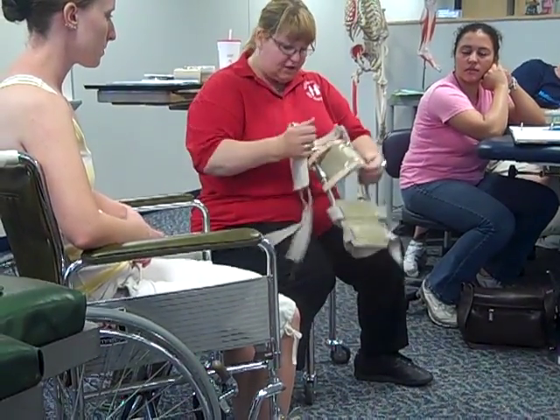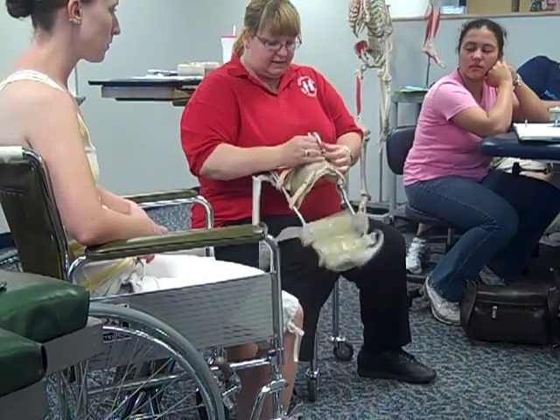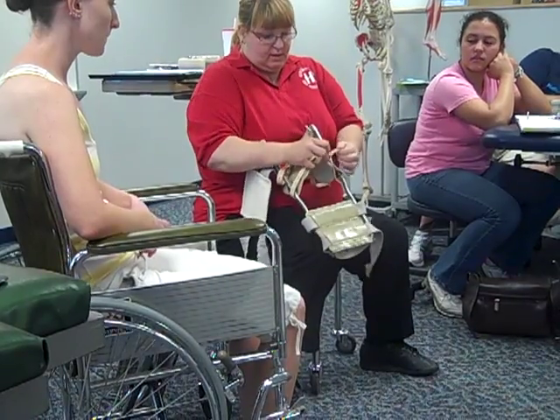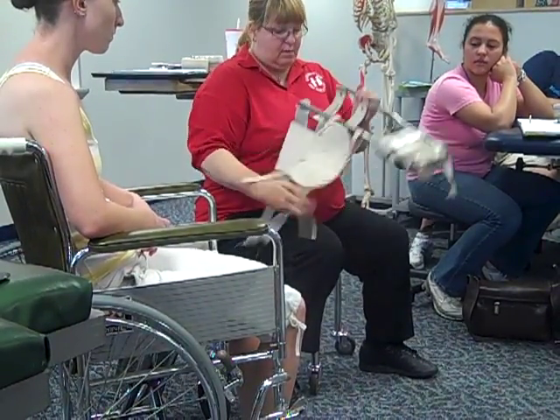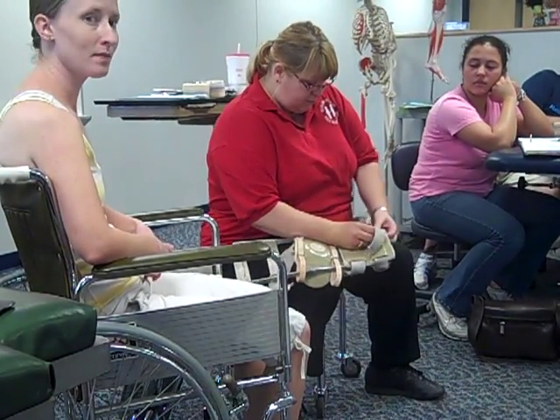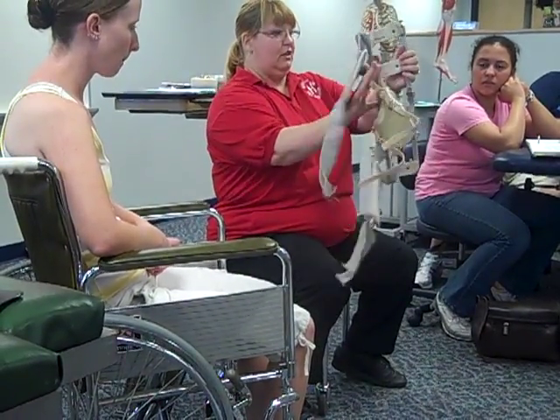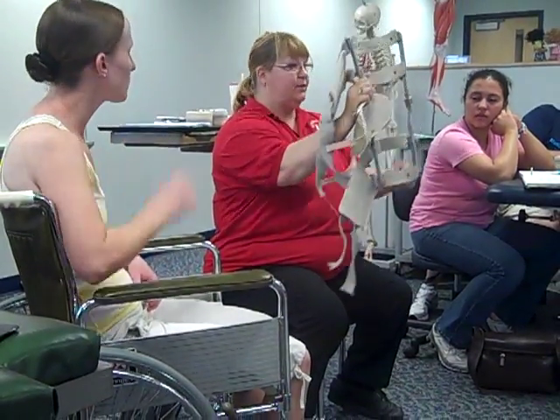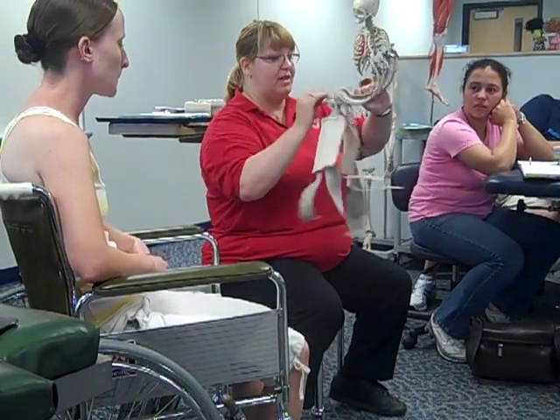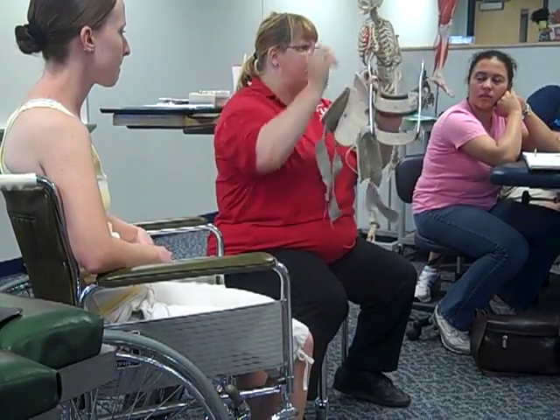So this is the knee cage. First, make sure all the straps are loose, and it's easier if they're all loose on the same side so they open in the same direction. There's a larger end and a smaller end. The metal part goes behind the patient's knee — you can tell which way it goes because it bends in that direction, so it has to go underneath the patient's knee.